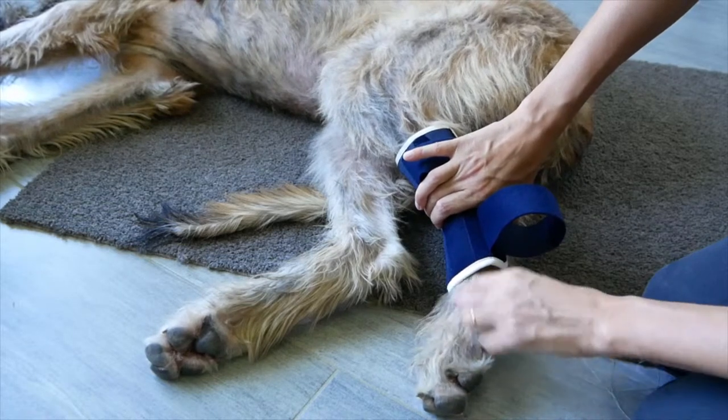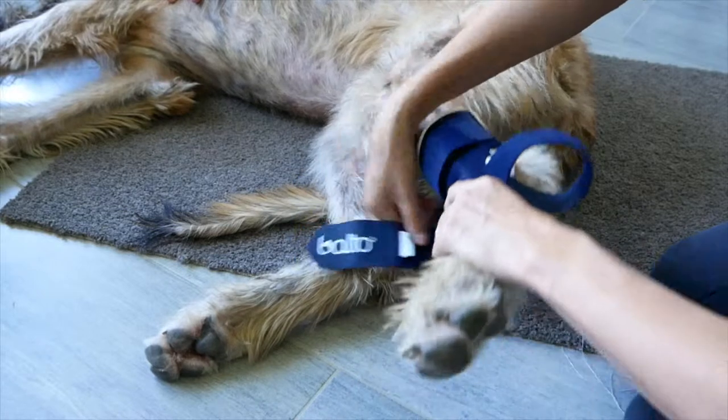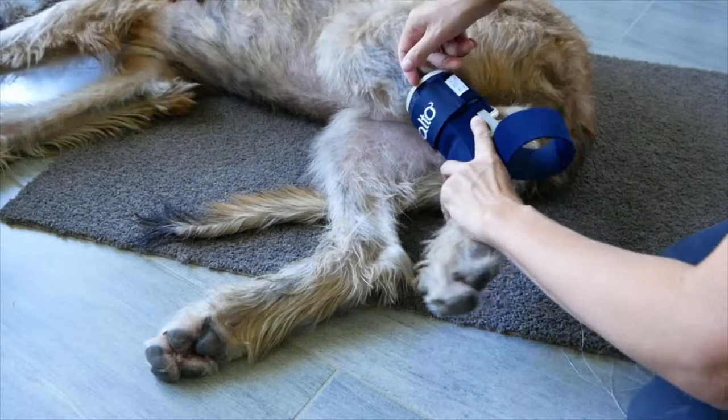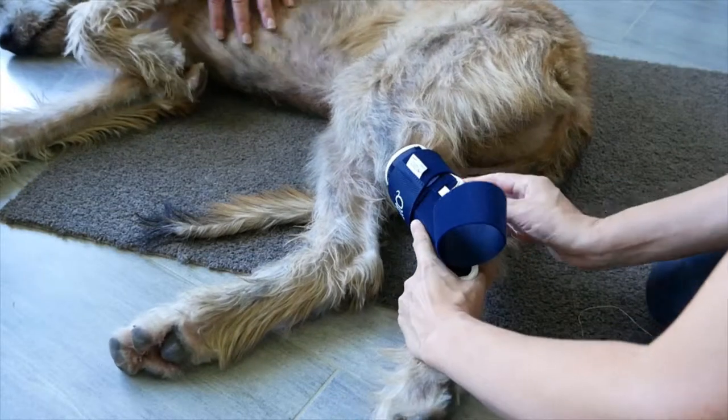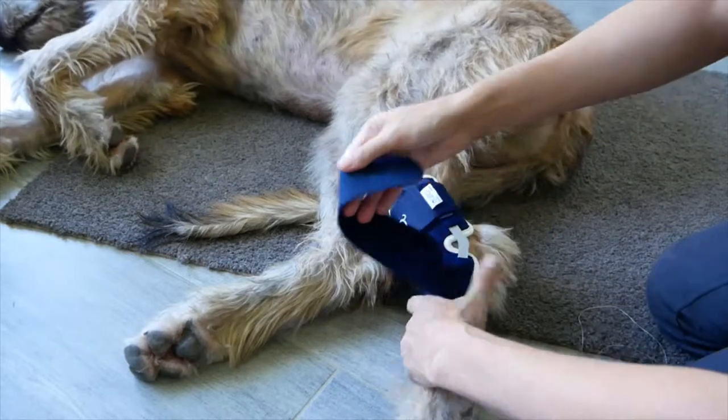Make sure that it's long enough for the brace to fit properly without rubbing against the toes when your dog is walking. Then, simply close the straps around the hock and adjust them. Do not close the upper strap too tight against the tendon.